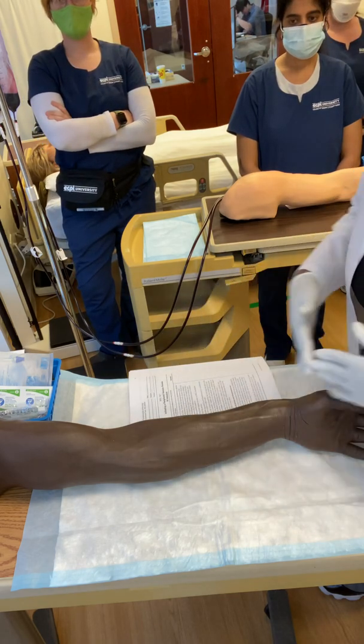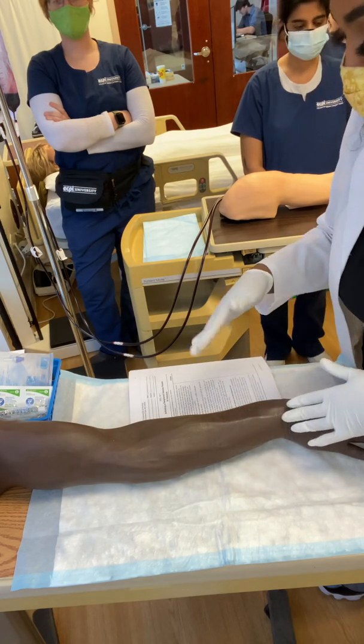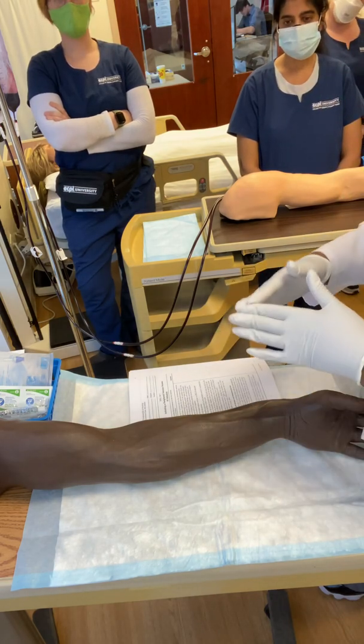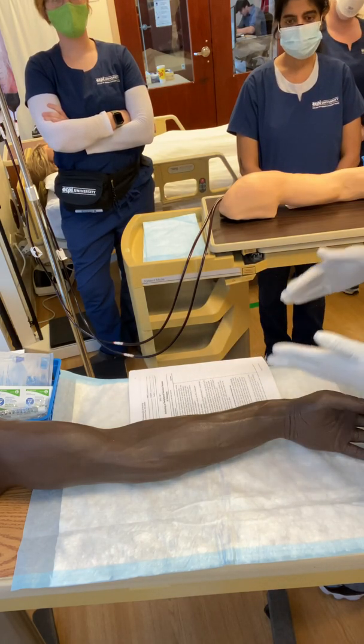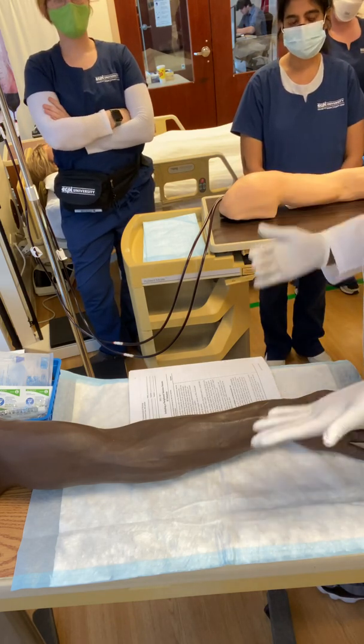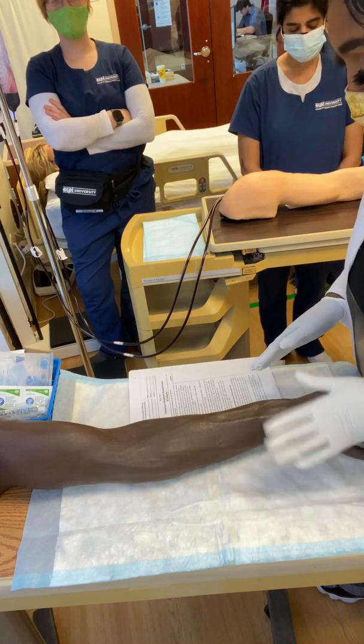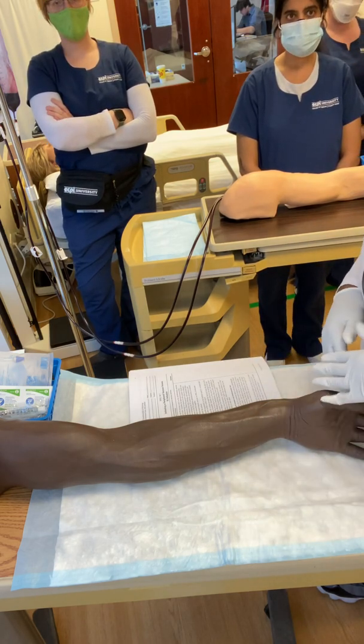All right, so now we're going to look at our patient. We're going to look at our site, okay? We're going to look for the color. We're going to see if there's any bruising. If they have bruising, hematomas already, we don't want to use that site, okay? Because that's just going to intensify the situation and cause even more sites of infection, okay? So now that we look at our site, we have everything right.